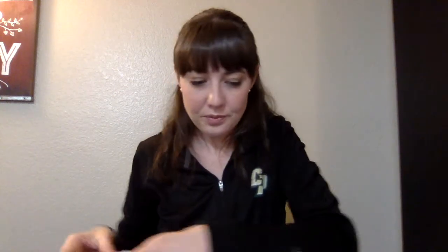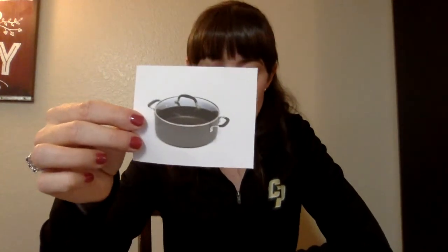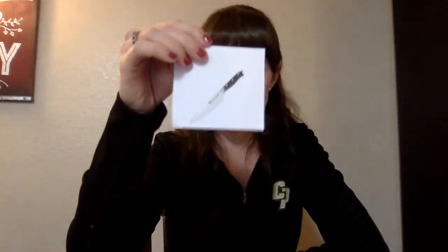So what you'll do is you will hold up this for 2 seconds without saying anything. Put it down and then say the word, having the patient look at your mouth. Pot. If they think that this image and this word, pot, match, they're going to push the green button. If they don't think those match, they will push the red button. And so you will go through each of those nouns just like that. So the next one would be like this. Knife, green or red.